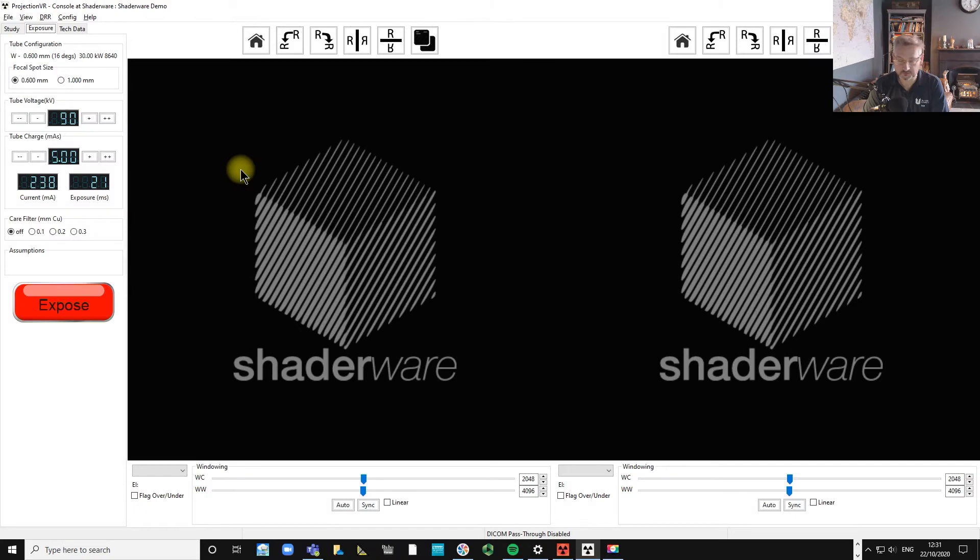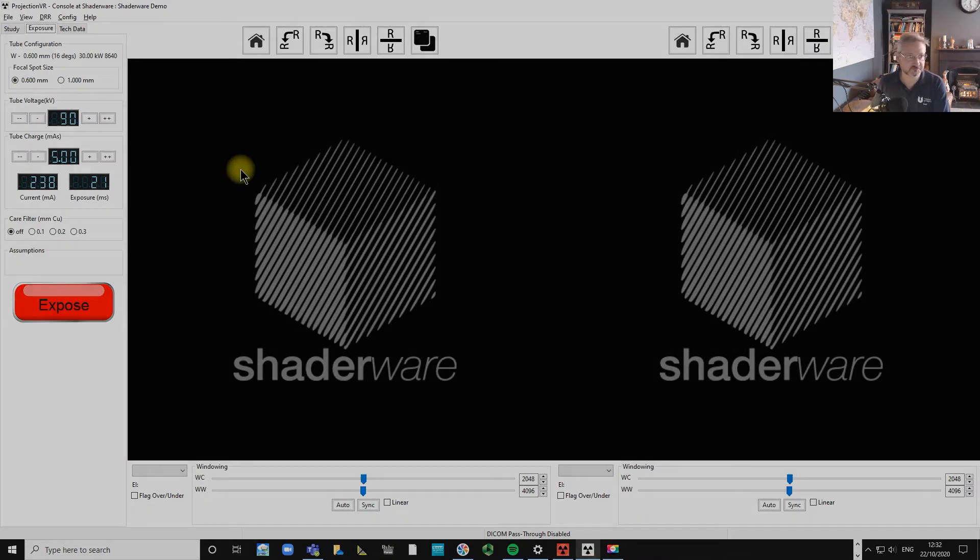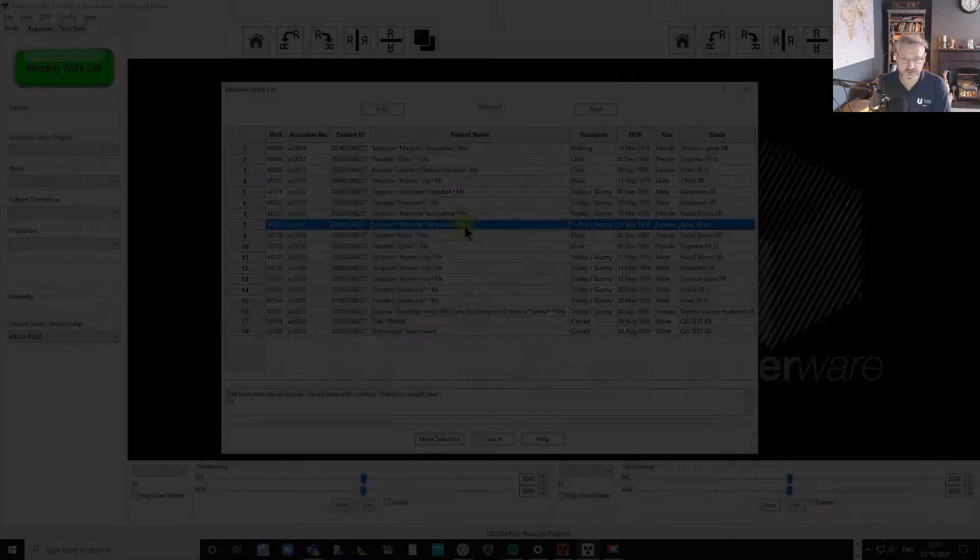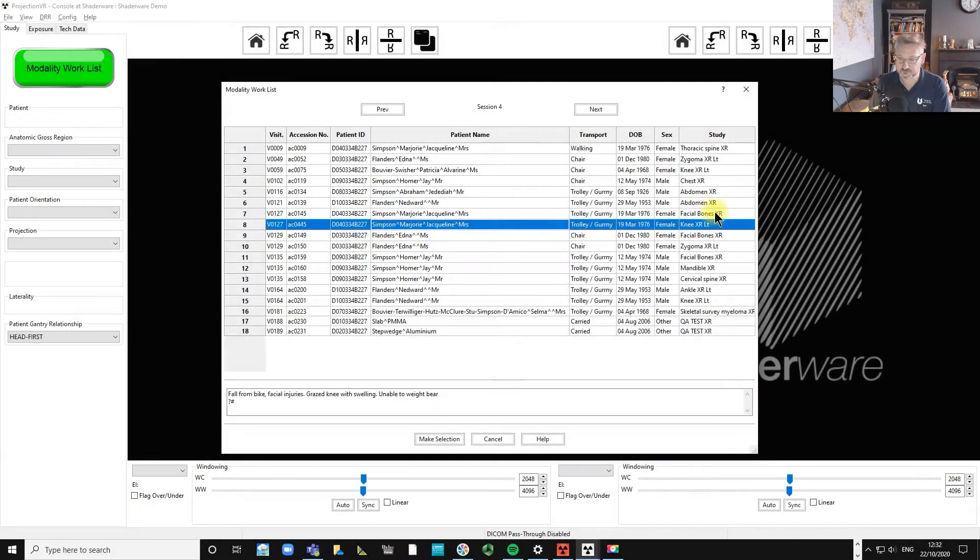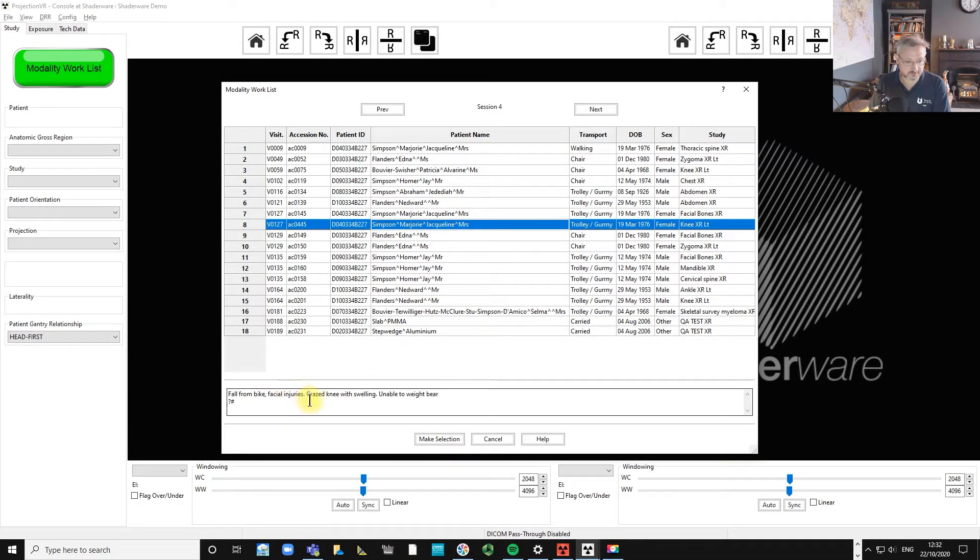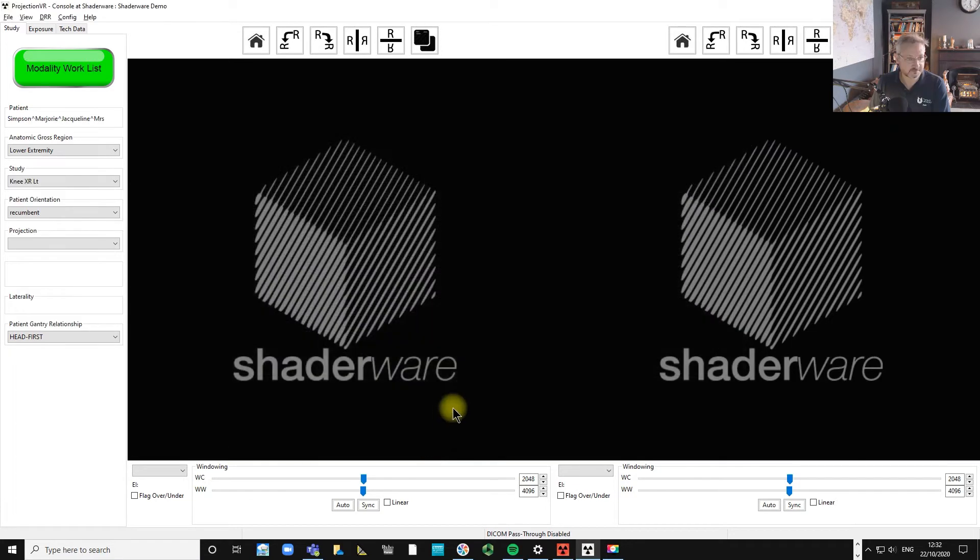In this video we're going to look at horizontal beam lateral projections of the knee. Jacqueline Marjorie Simpson, born 1976, she's fallen from her bike, she's grazed her knee with swelling and she's unable to weight bear. Query fracture.